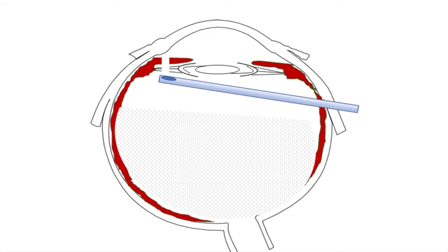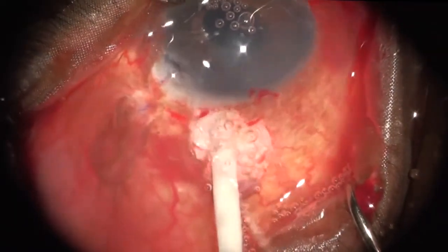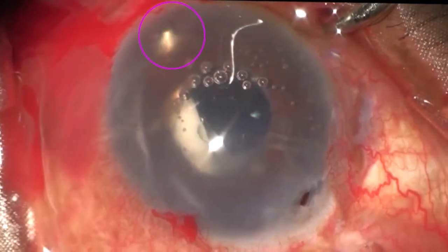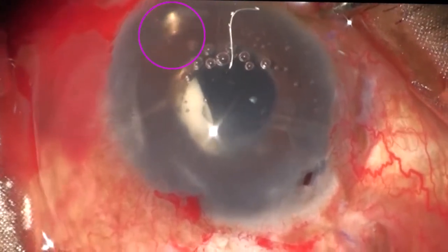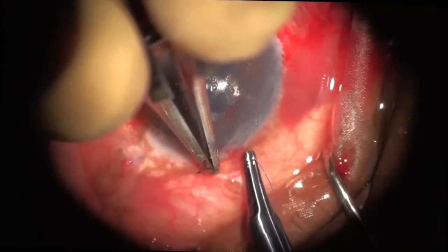This is followed by zonulectomy and iridectomy at the opposite limbus via a posterior to anterior approach. A mark is made on the vitrector for guidance intraocularly. Zonulectomy is then done, followed by iridectomy as seen here. The pars plana wound and conjunctiva are closed with Vicryl.